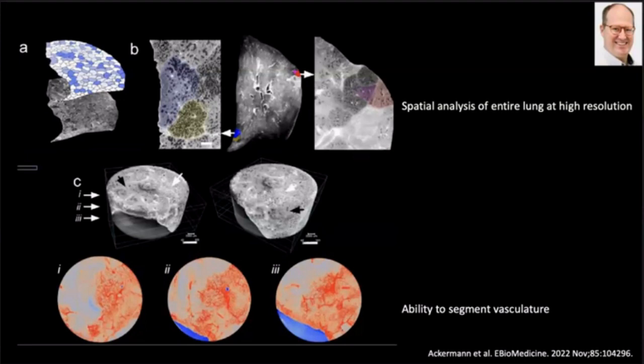And to remind you, this is something that is very, very challenging to see on a regular CT, because the anatomical unit is just too small to be reliably resolved on a regular CT scan. So this is why we need this kind of information. If I were to look at this on a micro-CT level, I think everything would be dense, so everything would be dense white and would also fail to yield meaningful information. And here, for example, you can see these two different units there and there, with different examples here.